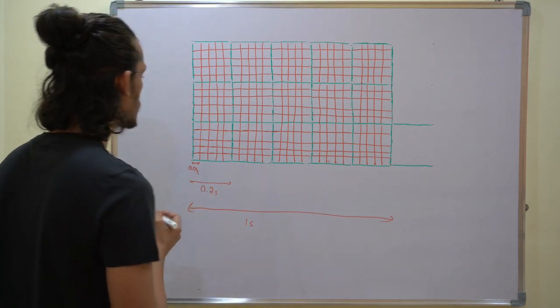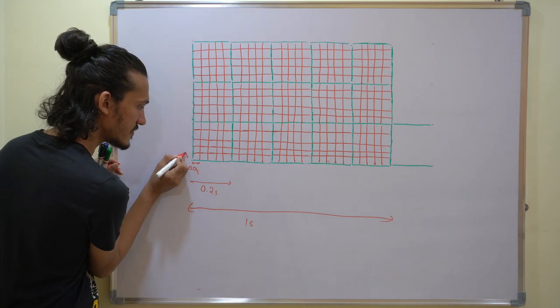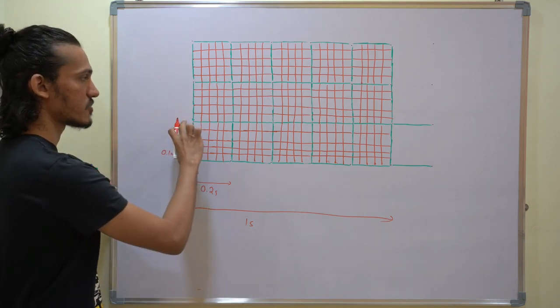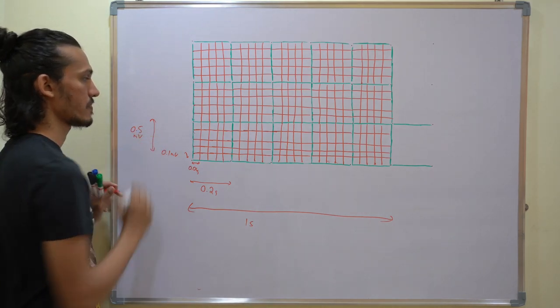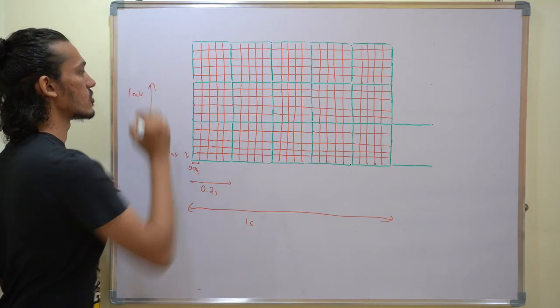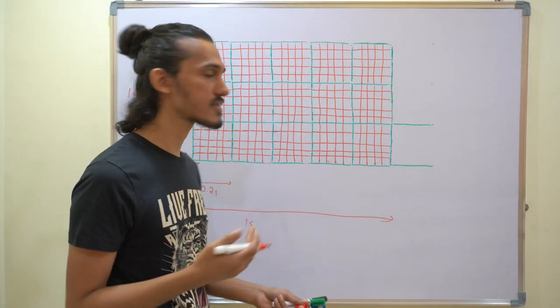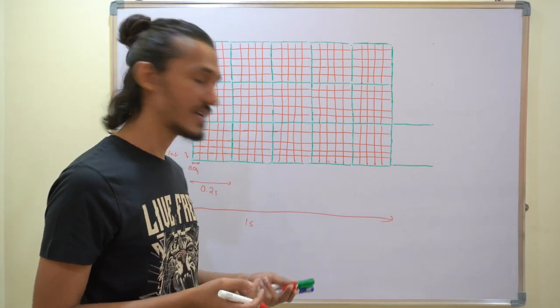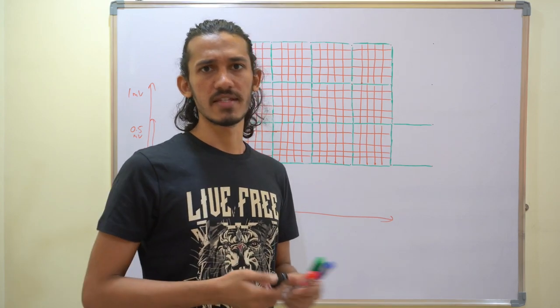The next thing is the amplitude. The amplitude is pretty simple. Each one small division accounts for 0.1 millivolt, right? So one large box would be 0.5, and two large boxes would make up 1 millivolt. So before we take the ECG, we usually take a calibration and see that the two large boxes make up 1 millivolt. Okay, so now that you've got this picture, we'll try to draw the waves in the ECG.